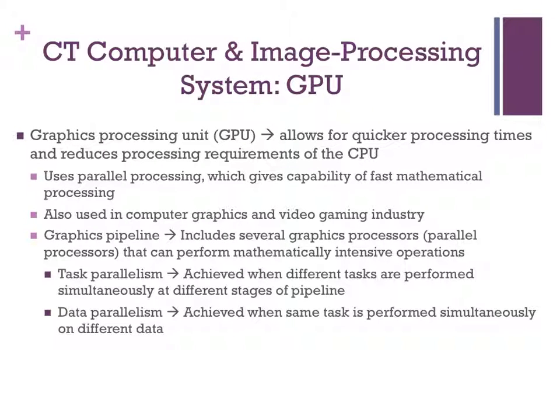Medical imaging and radiation therapy involve technologies that generate a large amount of data sets that are also made up of a large amount of similar elements. Processing these data sets quickly becomes an issue for the CPUs of modern computers today. The use of IR algorithms requires increased computational power even yet, and this is now possible with the use of the graphics processing unit, or the GPU. The GPU can be used to reduce the processing requirements of the CPU.